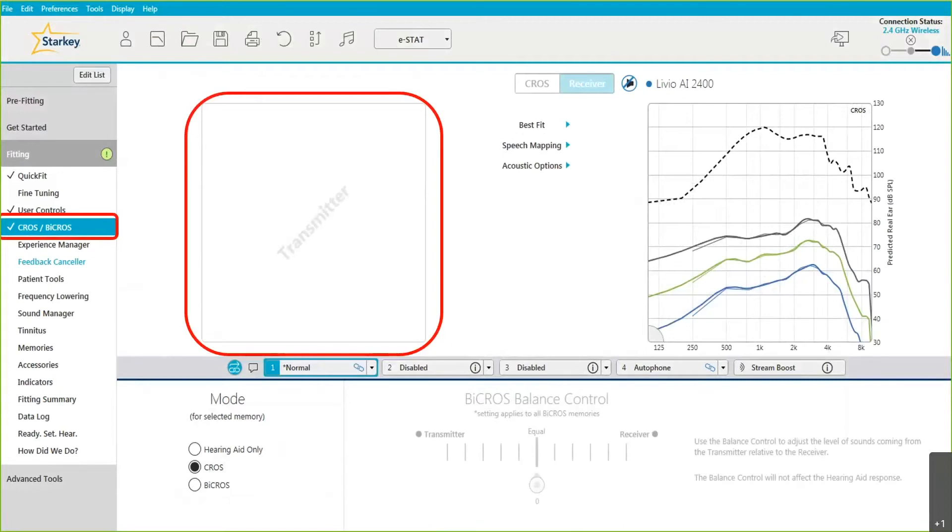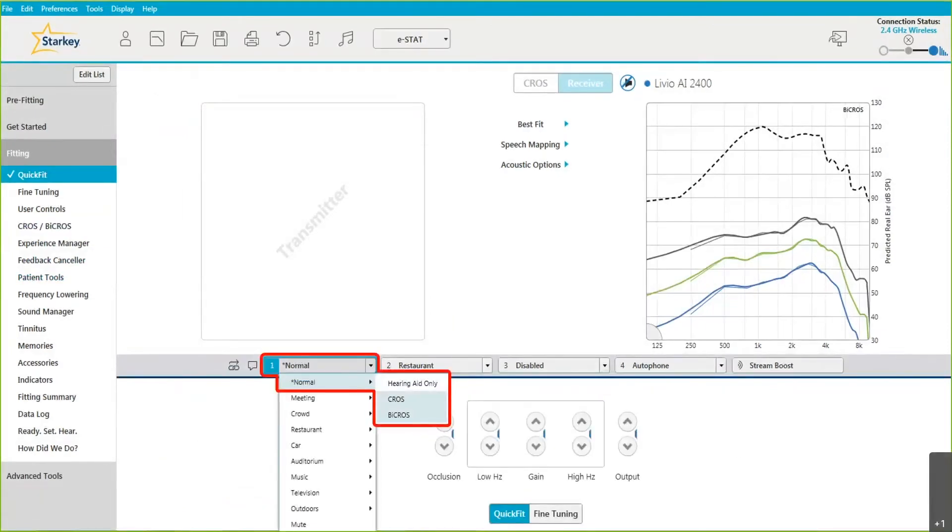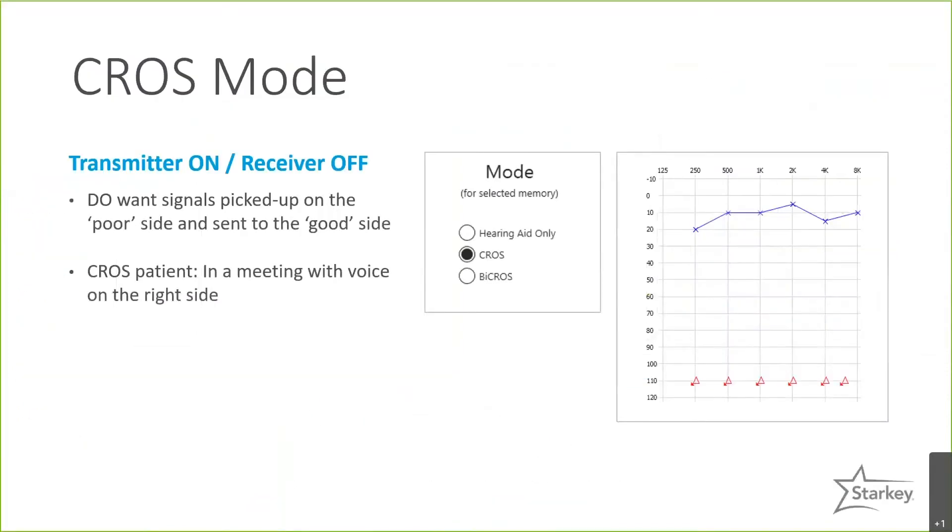One great thing about the CROS system is that it gives you, as the provider, a lot of flexibility in how you set it up for your patient. You have the option to choose per memory whether you want the mode to be hearing aid only, CROS, or BiCROS. When you click in the software while programming your memories, it will give you the ability to select one of these three options. In CROS mode, if it's a CROS patient with normal hearing on the better side, you don't need a microphone or any amplification on that side.